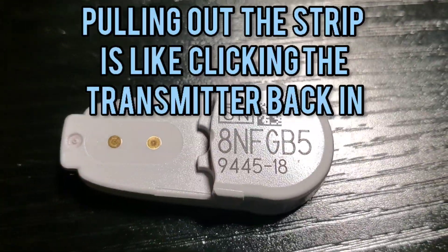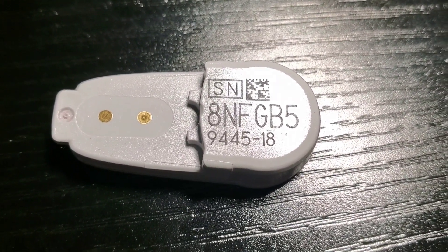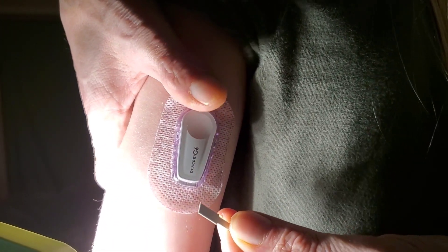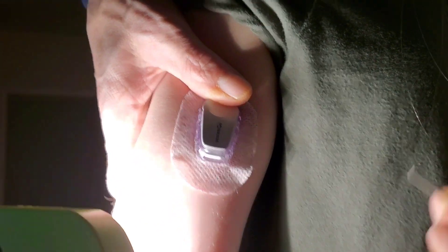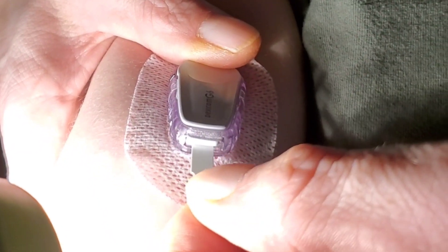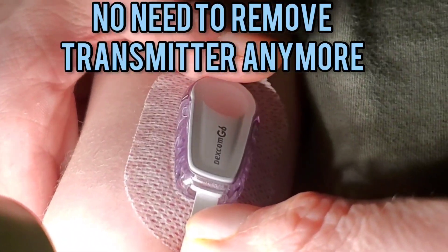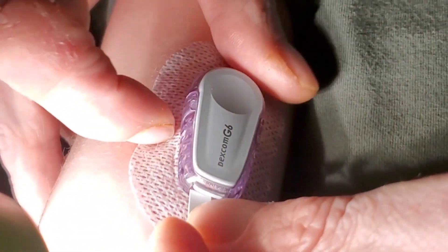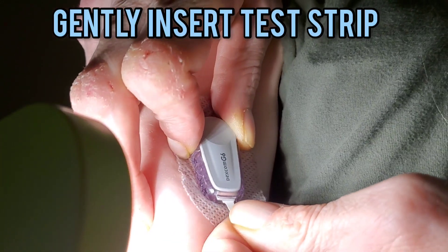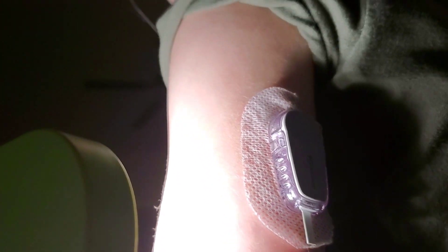When you pull it out, these contacts touch the inside and make contact again and recycle. This is the transmitter — if you look underneath, you see that little slot right here. It slides under, so there's a top and a bottom. You're going to shimmy it in, hold your thumb up here to keep it from moving, keep it stationary, and shimmy it on up in there. You want to go until it stops, then leave it like that.